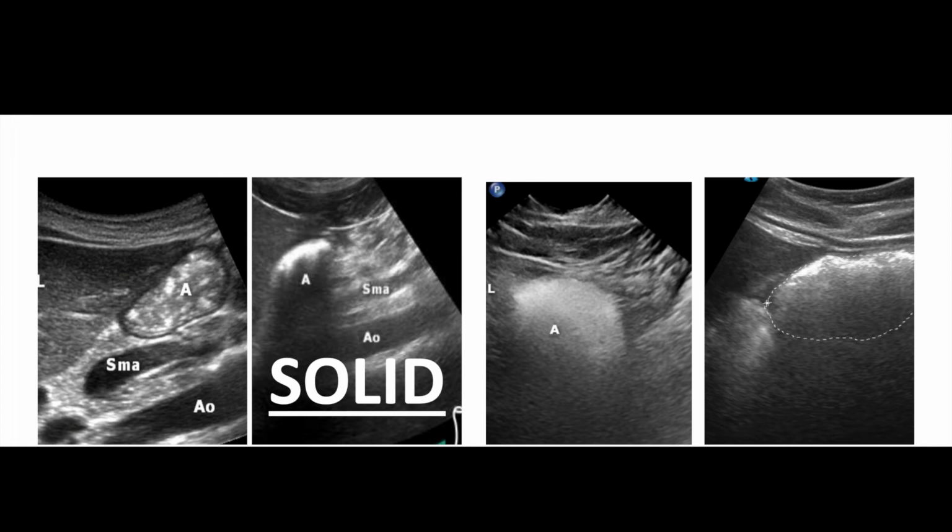In the early stages, the gastric antrum will be distended and a thin muscle wall observed. Due to the consumption of food and air when eating, there will be a mixed echogenicity giving a frosted glass appearance. This blurs the posterior wall and deeper structures on the ultrasound, making them harder to appreciate.